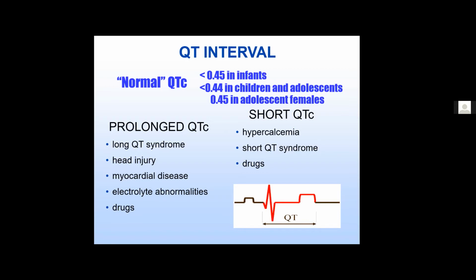And there are also several other causes besides long QT syndrome, but any type of head injury. Be very careful if you have a patient who passes out and has a concussion or a subdural and you get an ECG and the QT is prolonged, because any type of head injury, syncope, myocardial disease, electrolyte abnormalities can cause prolongation of the QTC, of the QT interval. So it's important to repeat that measurement several times before you make that diagnosis.